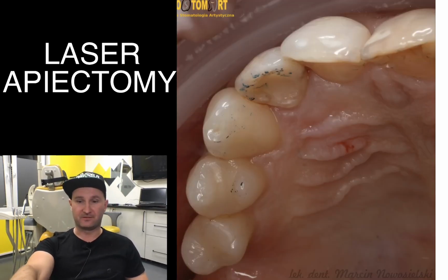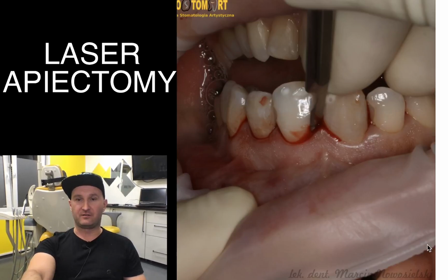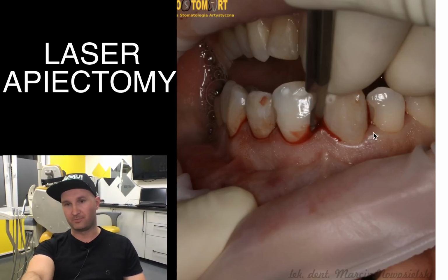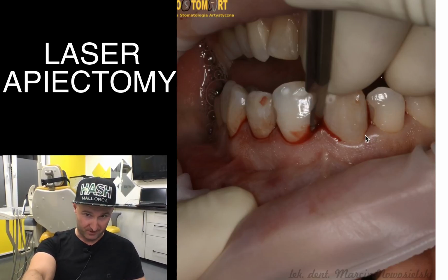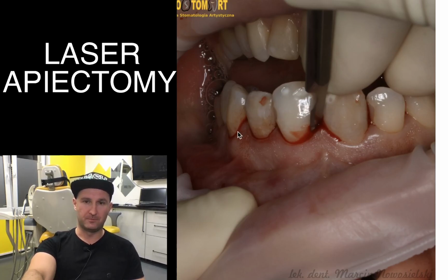So this is the labial view, this is the palatal view, and we started with incision. Incision was performed from the mesial part of tooth number 1-1, and it proceeded to tooth number 2-4.